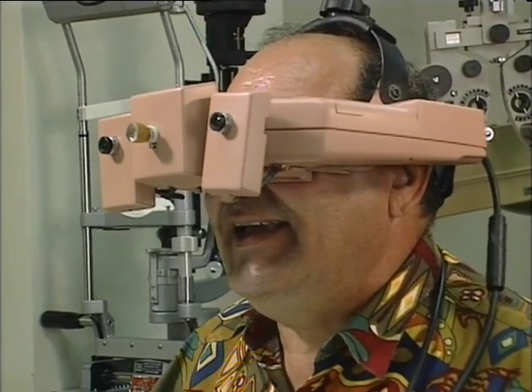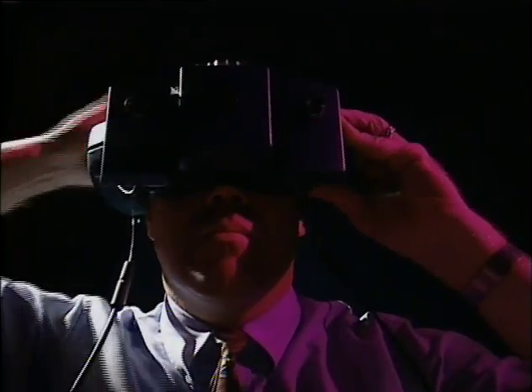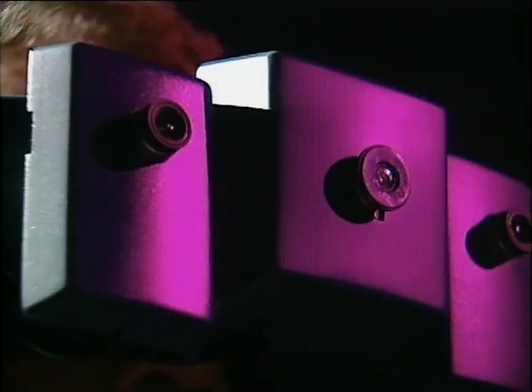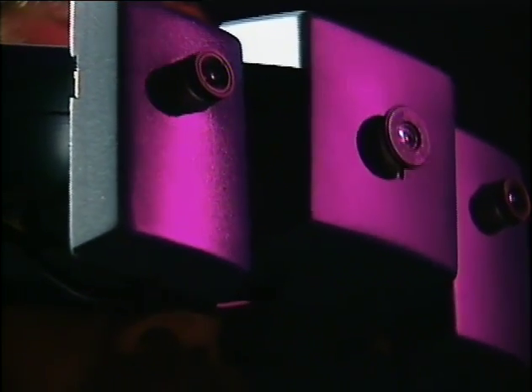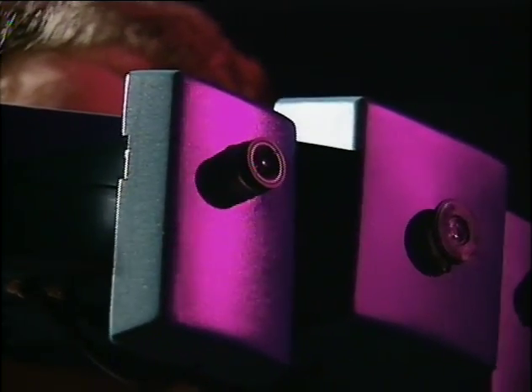And it's just wonderful. The system was designed in Baltimore by the VA and Bob Massof of the Wilmer Eye Institute. The ultimate goal is to tackle even the most difficult problems for low vision patients, like reduced contrast. To give you an idea of what patients might experience, we've reduced the contrast of my image, and amazing as it is, it's at least this bad, sometimes worse for many of these patients. They will complain of not being able to recognize family members, their own spouses and children.